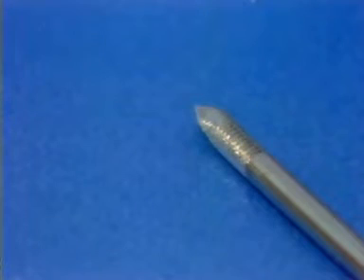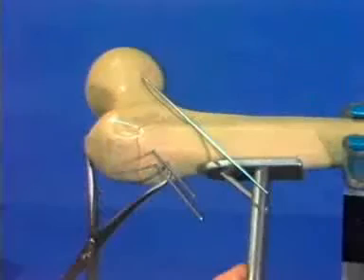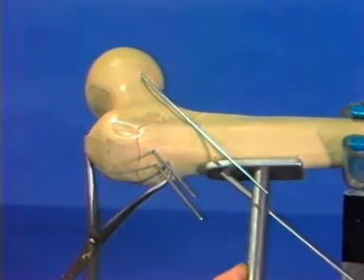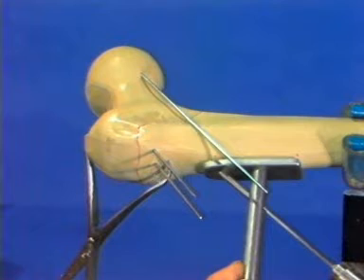The guide pin with the threaded tip is now used. The pin is placed in the small Jacob's chuck. Using the small air drill and 135 degree guide, the pin is placed through the head and neck, parallel to the previously placed anterior pin.